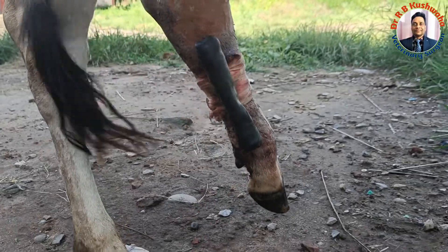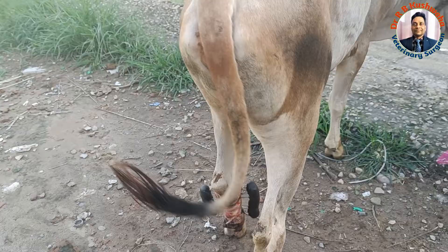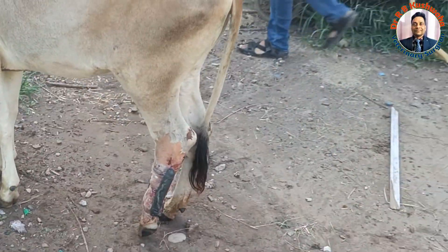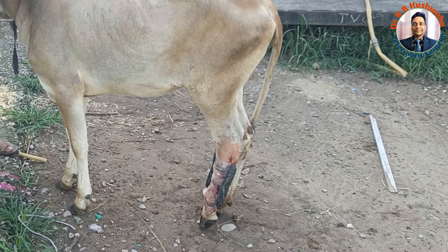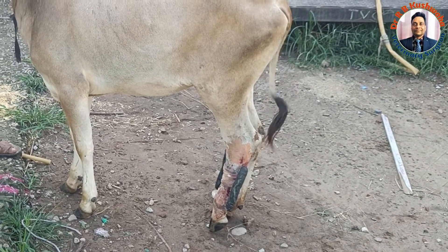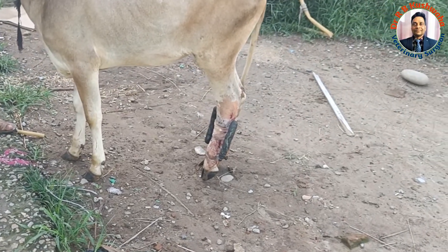We have managed the case today. If you see the weight bearing, the animal is still walking and little bit touching this toe while walking, so that is a good sign. With this linear fixator, the reduction of the fracture fragment is quite good.